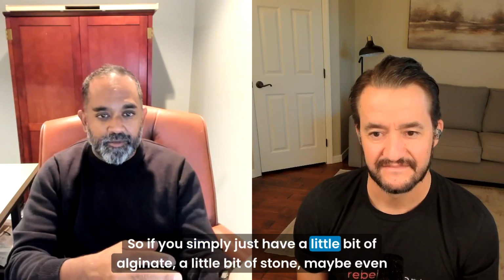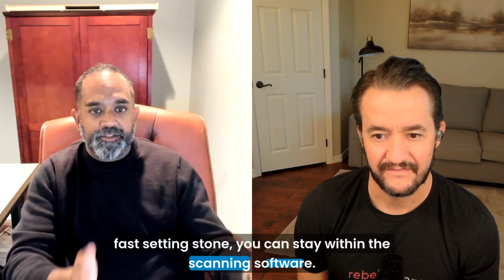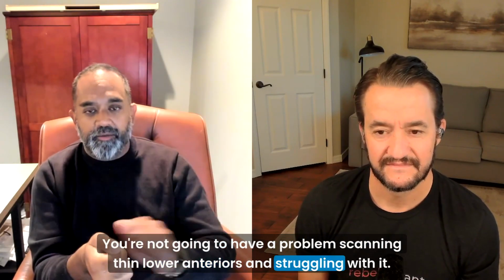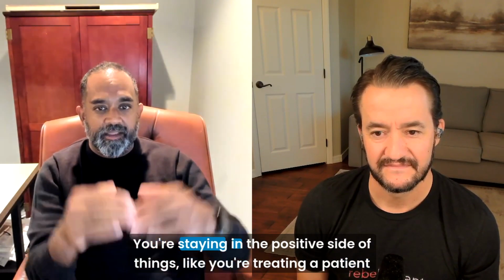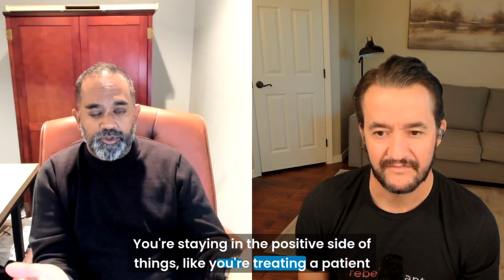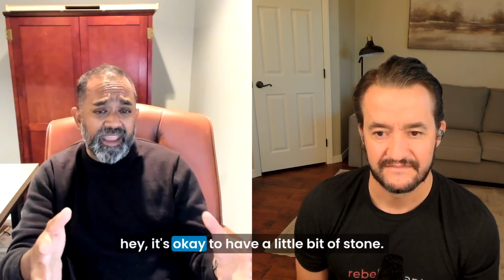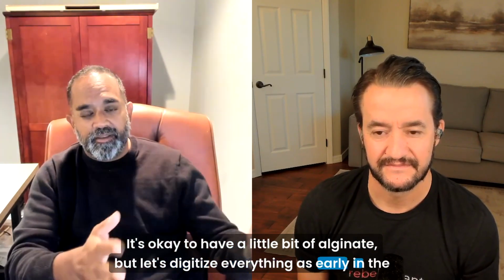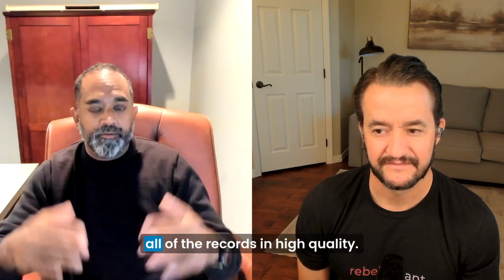So if you simply just have a little bit of alginate, a little bit of stone, maybe even fast-setting stone, you can stay within the scanning software. You're not going to have a problem scanning thin lower anteriors and struggling with it. You're also not going to have this issue of flipping a negative to a positive. You're staying in the positive side of things, like you're treating a patient through the whole workflow. And so those are things I just kind of learned on the job to try to figure out, hey, it's okay to have a little bit of stone. It's okay to have a little bit of alginate, but let's digitize everything as early in the process as we can so that when we get to a computer screen to design the teeth, we have all of the records in high quality.